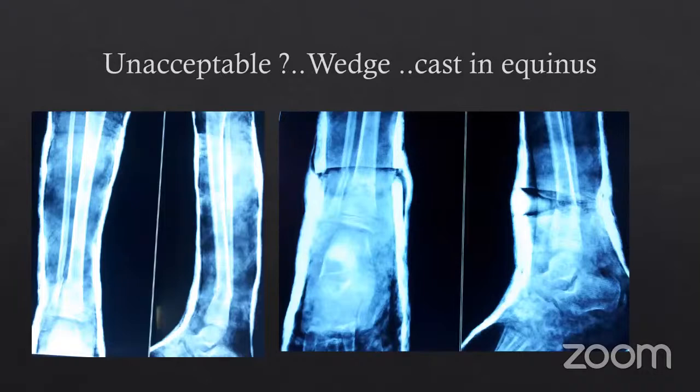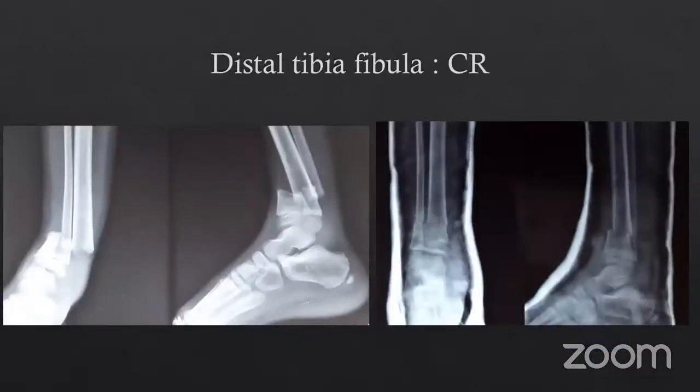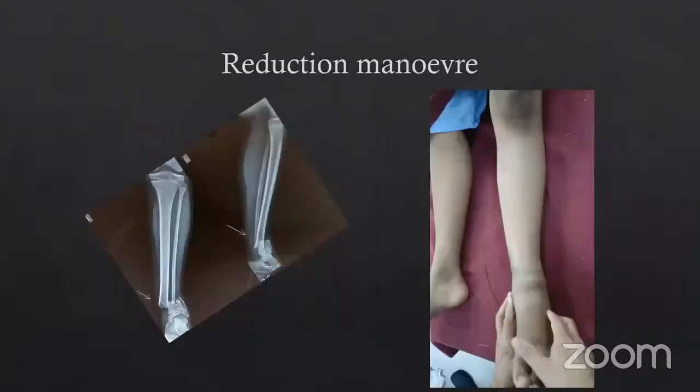If it is unacceptable, you can see this lateral x-ray. Unacceptable, this is going to cause a problem, you can wedge it. You can see an anterior wedging here and correction of that into correct position. Distal third tibia fibula, like the distal radius ulna, is a childhood fracture. Closed reduction usually works, but you must exaggerate the deformity and you may use percutaneous K-wires.